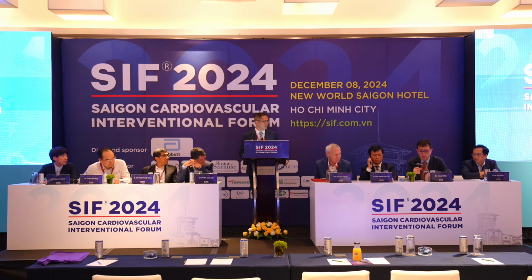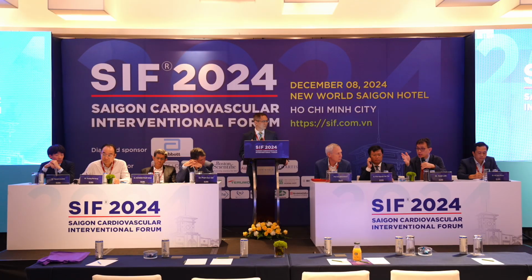Yeah, in my experience, in a high thrombus burden lesion that's resistant to reperfusion with ballooning, I find that small dose intracoronary thrombolytics actually work very well. The main thing about using it is you need to give it time. When you inject it, you have to wait for a while because it takes time to act. I've had it work very effectively in some cases. I don't tend to aspirate at the same time if I start to get flow back in, because it breaks up into a lot of fragments and your stroke risk, theoretically, depending on what you're doing, might be higher.